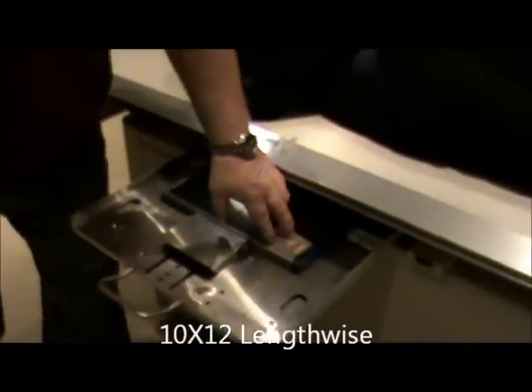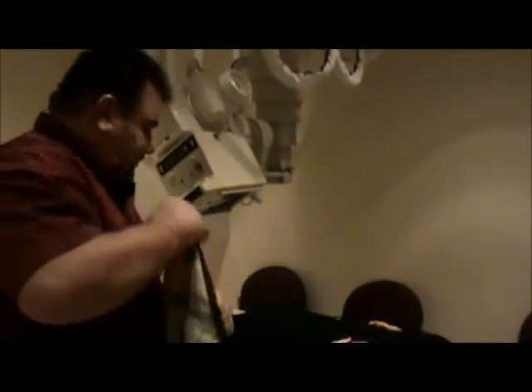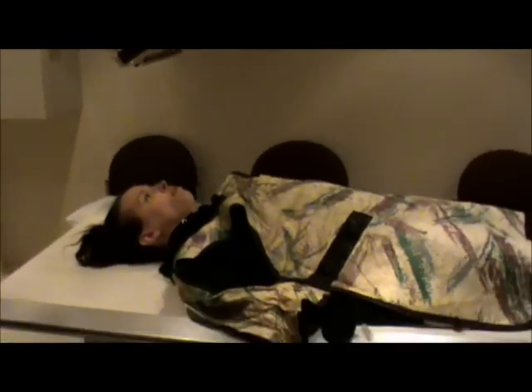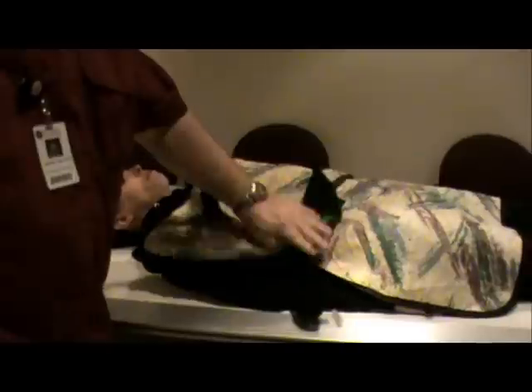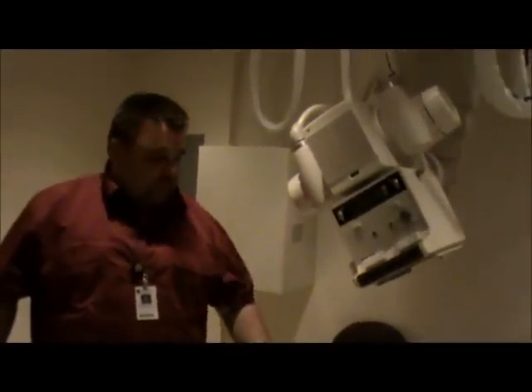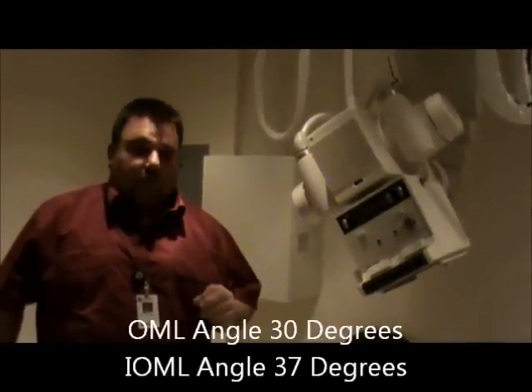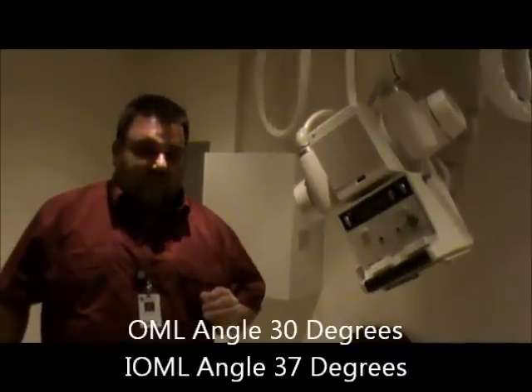The first view we're going to demonstrate is the Towns view. We're going to use a 10x12 lengthwise with my right marker. For head work, we use a full body shield on the patient. As for tube angle: if the patient is able to get the OML perpendicular to the IR, we angle 30 degrees. If the patient is unable to do that, we use the IOML and increase the angle 7 degrees to 37 degrees.